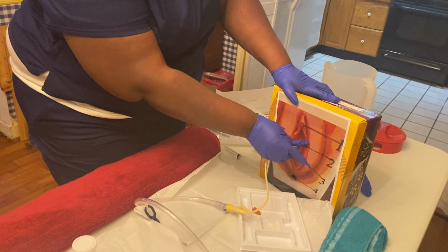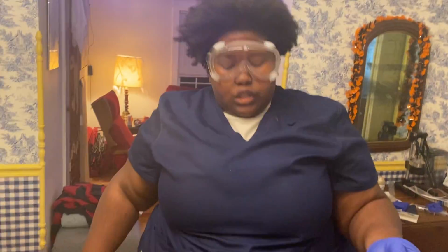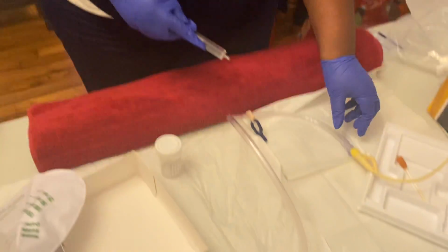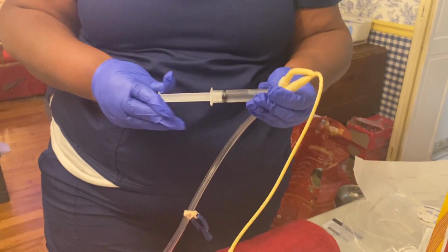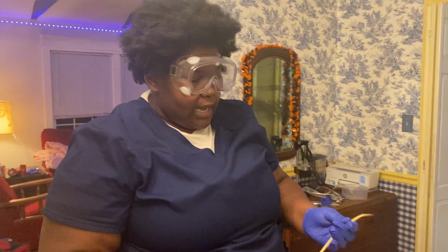It should be in. And then I will slowly, with my syringe, release the balloon by gravity, with 0.5 milliliters by gravity. And then it will slowly come back, and it will release, and then I will slowly pull this out.